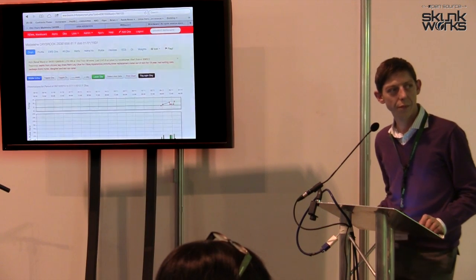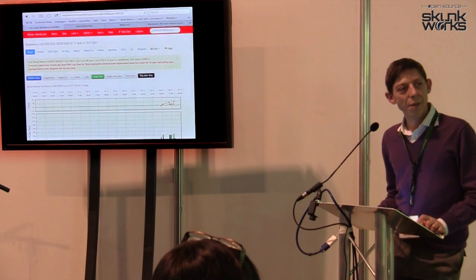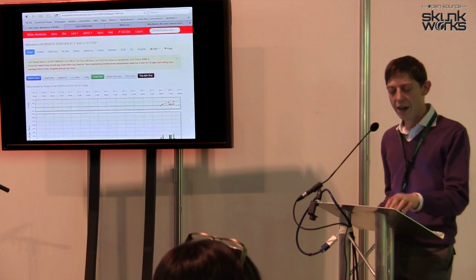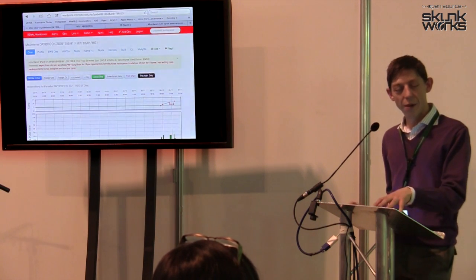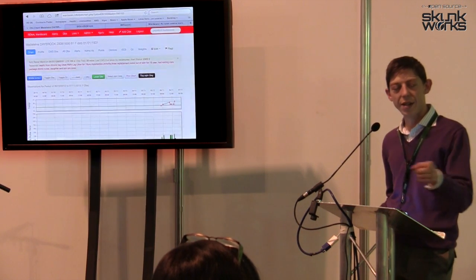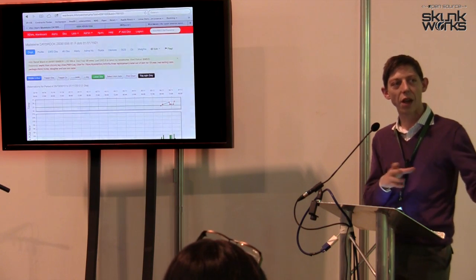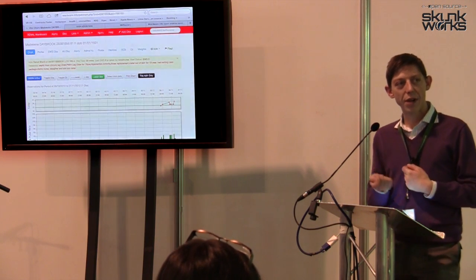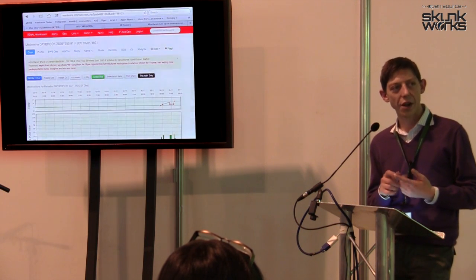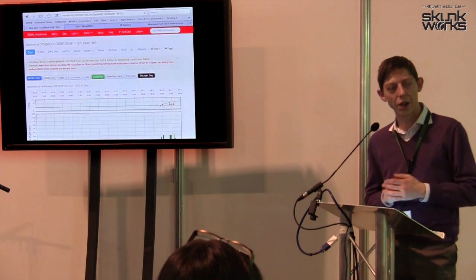If the wireless goes down, how would you take observations? Well, this is one of the things that we've been working on with King's and with Luton, to have some sort of business continuity plan. So one of the things we do, if the wireless network has gone down or if the EPR is down for some reason, is have a system whereby a paper version can be created quite quickly showing all the last observations for a patient, and that can be printed out. Most trusts that we've been working with have a PC and a printer on a UPS, and they just print out the charts, put them around the beds, and they can carry on capturing the obs.